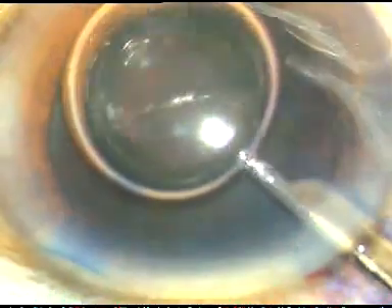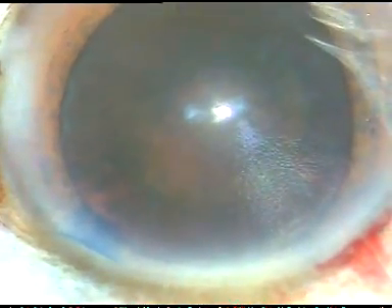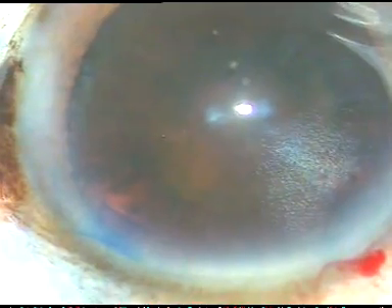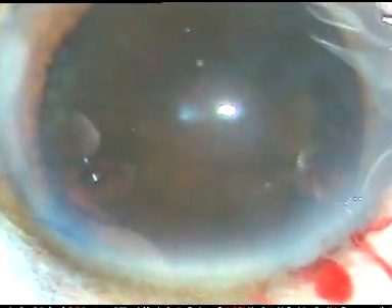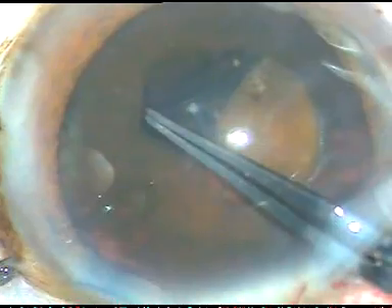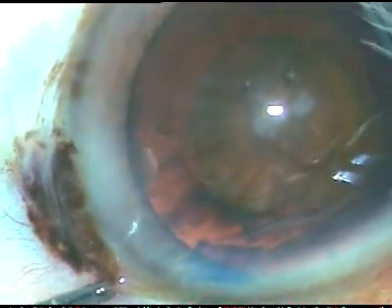In this case I want to do a rexis of about 5.5 mm size. I don't want to make a very large rexis because I know there can be PC rent and I may have to place a lens in the sulcus. And if the rexis is about 5 mm, then optic capture will be easy. Here I am just raising a flap of anterior capsule. I hold this flap with a utrata forceps and I am trying to make a rexis of about 5 mm or between 5 and 5.5 mm. I hope this is a rexis of adequate size.